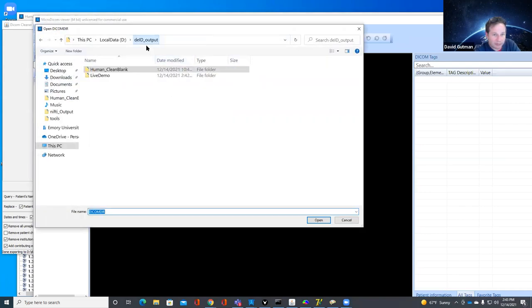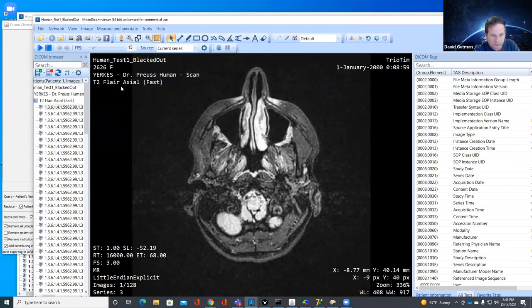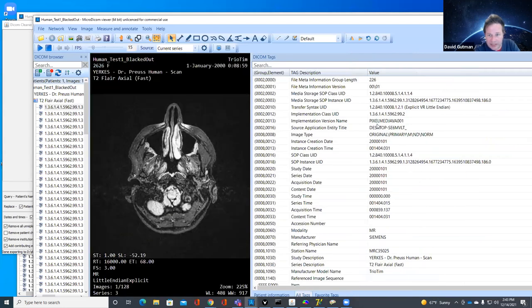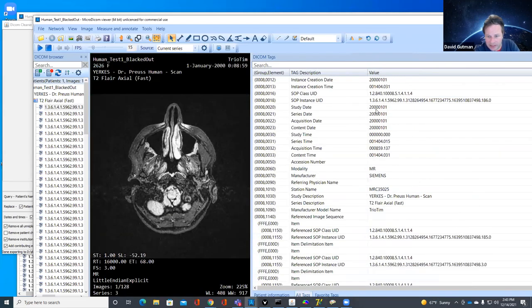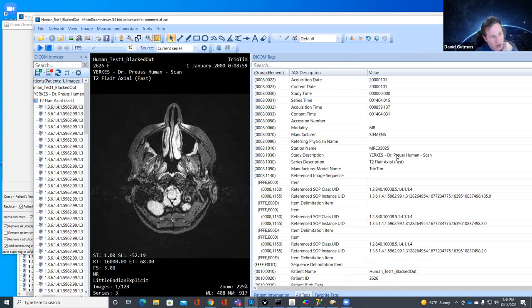I'm going to open a DICOM directory for the live demo. You can see the scan date is now January 1st, 2000 — the scan was definitely not acquired on that date, so it did a good job of removing the date. This is where we're talking about doing that secondary review. As I'm skimming through, I notice I did not remove the study description — I didn't click that box — so it still says 'Yerkes,' which I know is where one of my friends works.